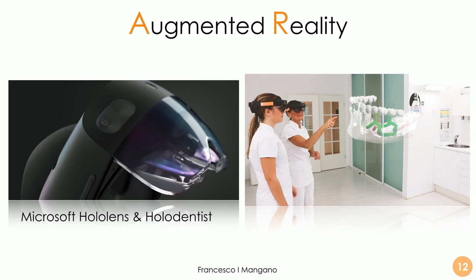How to use this model? There are several potential innovations. I just want to mention one we are working with. We are preparing some research. We use augmented reality with HoloLens 2 from the Microsoft company, and HoloDentist, a proprietary software from the company 15 Genium, located in Milan.